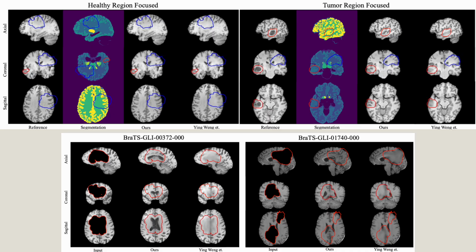Here, the top row is the development set. The blue outlines, as you see, are the healthy mask, and the red outlines are the tumor mask. We use the blue region to judge the reconstruction and compare it to the reference next to it. In the red regions, we look for tumor areas being filled with healthy-looking tissue. We can notice the smooth boundaries at mask edges, continuous texture, and consistent tissue contrast.